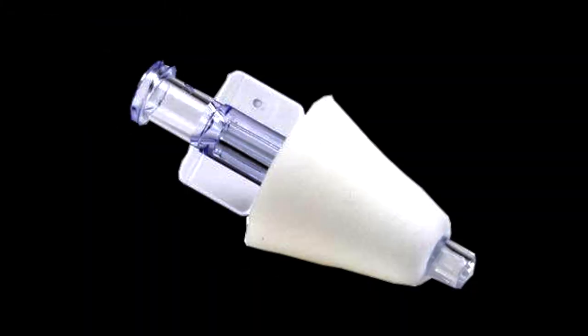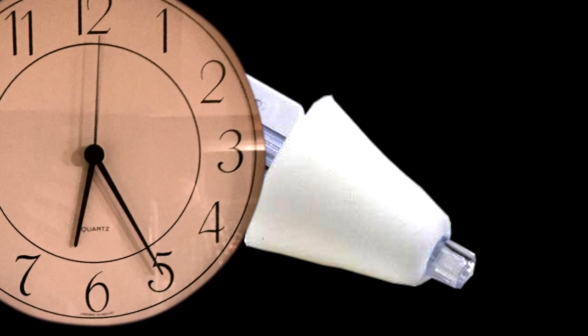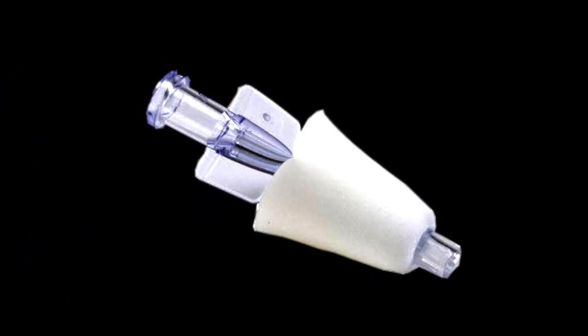The rate-limiting step in giving intranasal medications is getting the atomizer tip. A lot of departments don't stock them at all or keep them locked away somewhere where no one can find them in an urgent situation.